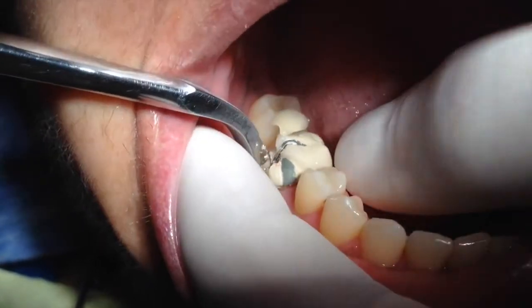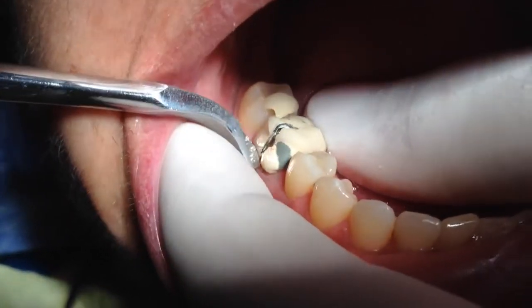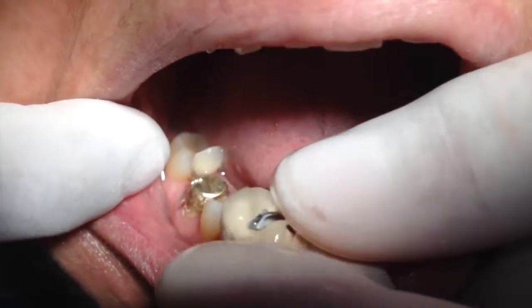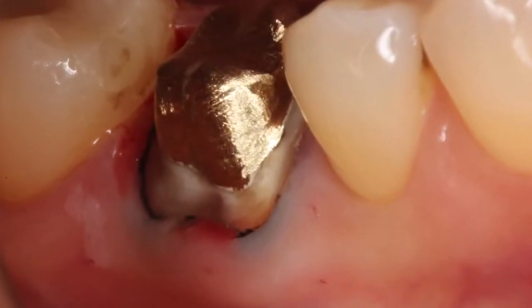The crown was removed. The tooth was re-prepared.